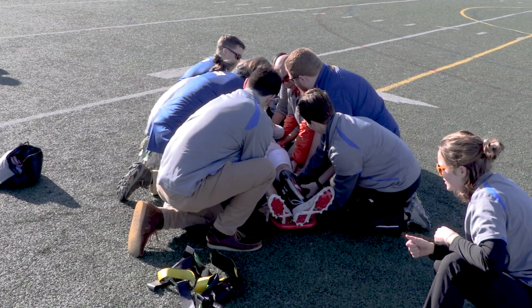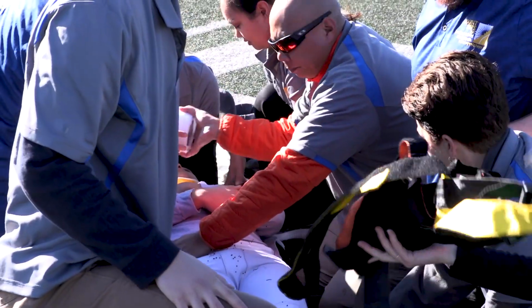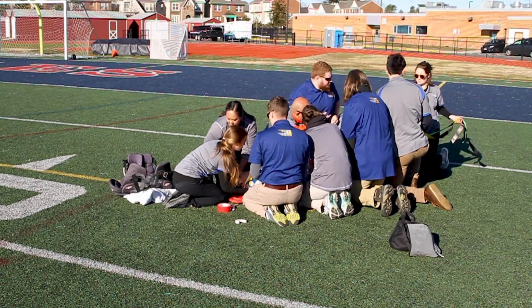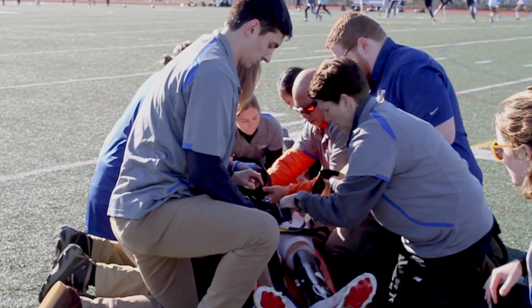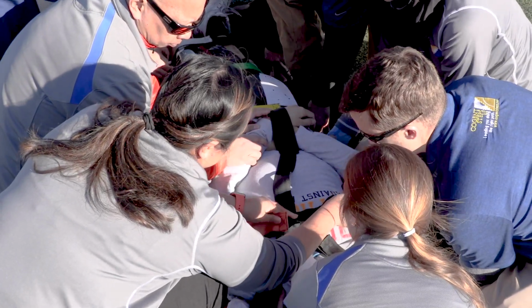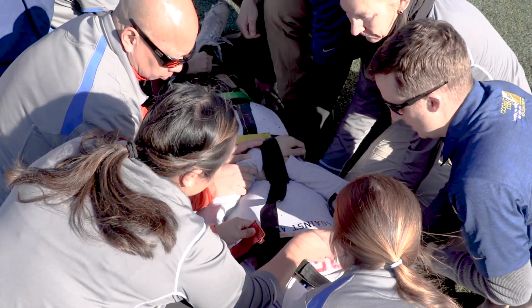Securing the athlete to the board now begins. The body should be secured first and the head last. When placing the straps, the hip should be secured and then the rest of the body from there. The athlete's hands should be placed in front and secured so as not to slip off.